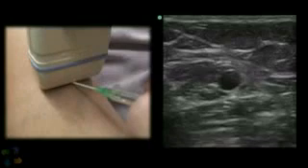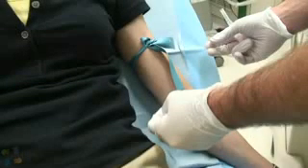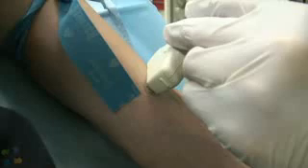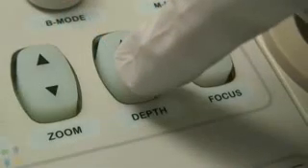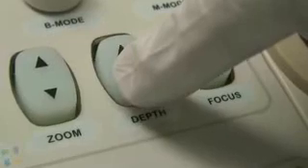In this setting, ultrasound guidance can be extremely useful. The vascular probe of the ultrasound will help you to visualize the venous anatomy of superficial veins and to approach deeper veins that are not palpable. First, apply a tourniquet to the upper arm. Place the vascular probe transversely on the patient's anterior arm with the dot on the probe facing to the right. Increase the depth on the ultrasound to better visualize the first 3 or 4 centimeters below the skin. Each mark on the side of the monitor corresponds to 1 centimeter of depth.